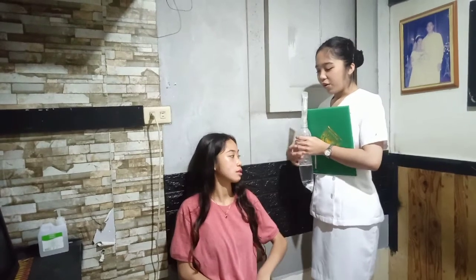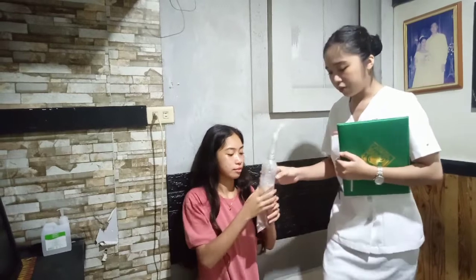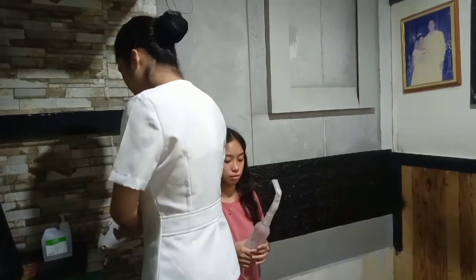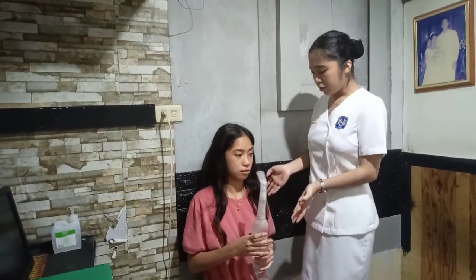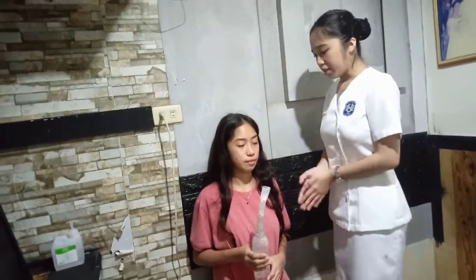Yes, of course. Okay, Ms. Shensen, thank you for your participation. Can you hold this first? I will do hand hygiene now. Okay, I have to assist you first into an erect sitting position. Okay, that's correct.